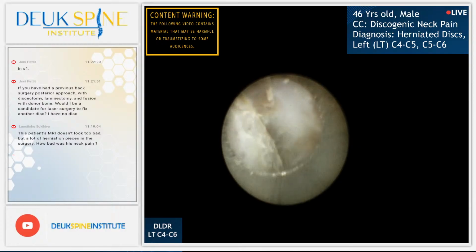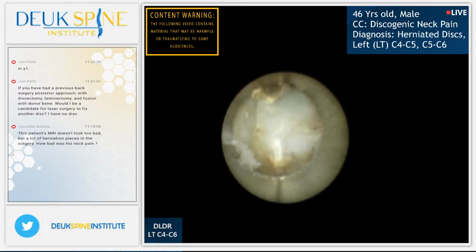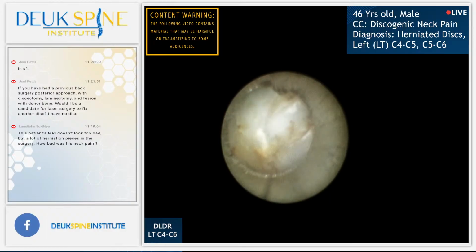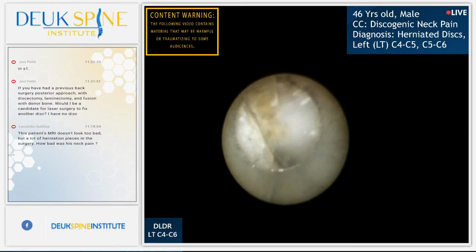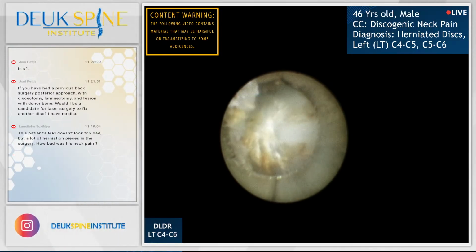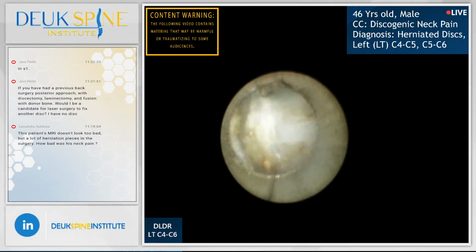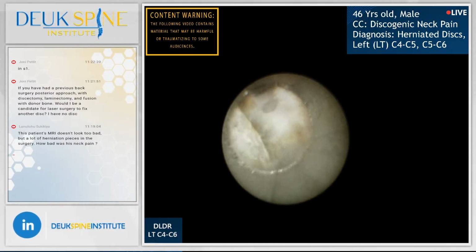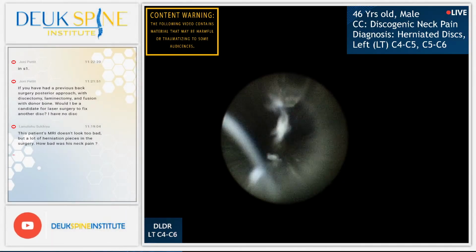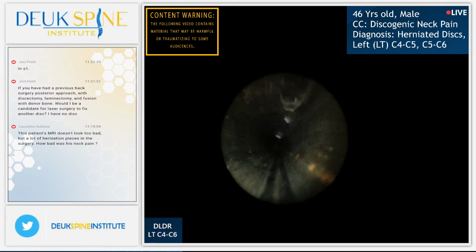All we're doing, look at all that inflammation, by the way, that red stuff. It's just crazy how much inflammation there is. All of that is due to the herniation. All right, we just cleaned it out, it's gone. Scar tissue here, lots of scar tissue. I cannot take all the scar tissue out, we don't need to. It'll just be replaced by more scar tissue. So what I'm going to do is get rid of the stuff that I think is a problem, leave the rest. We're just about done. I got about a minute or more, maybe 2 minutes left. You see all these pieces of herniation coming out of the tube, out of the disc and out of the tube.